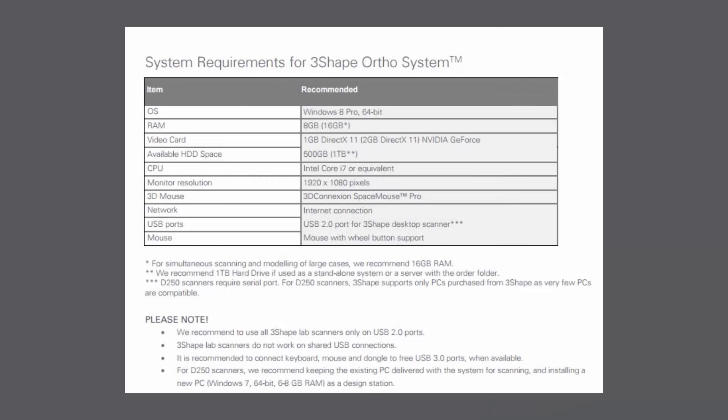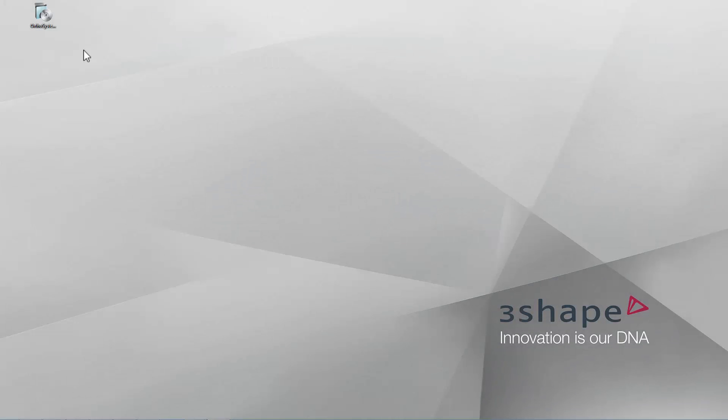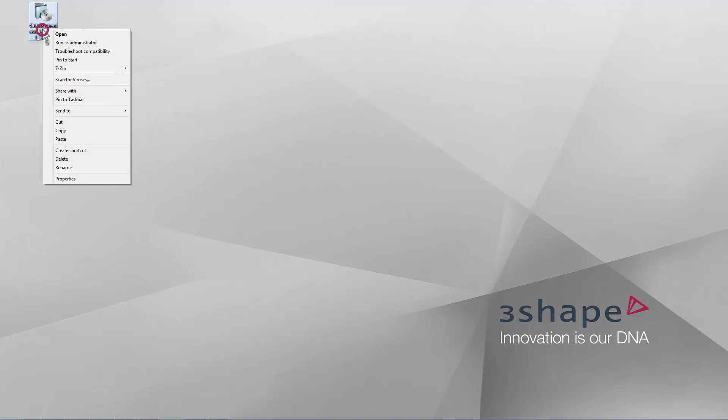Before you start the installation process, please make sure your PC specifications meet the requirements of OrthoSystem. Firstly, run the installation file as an administrator.